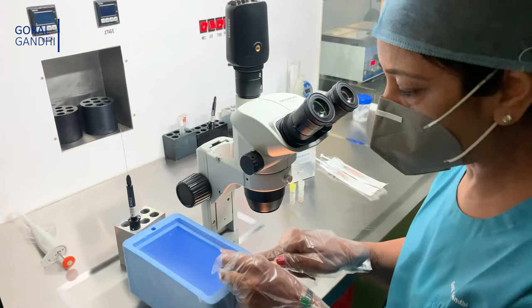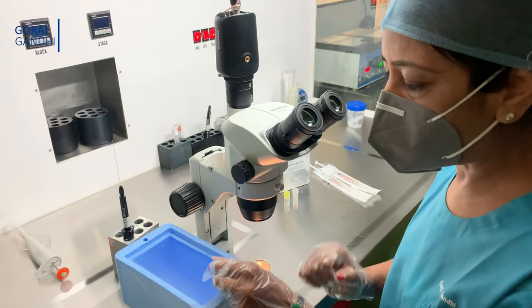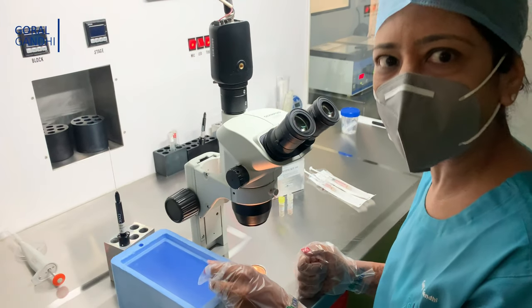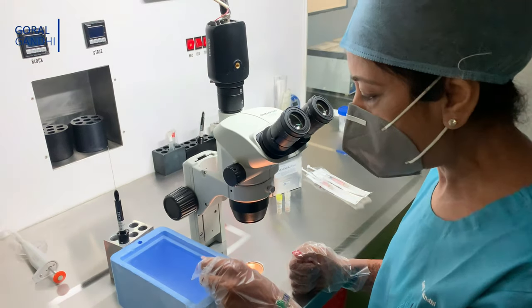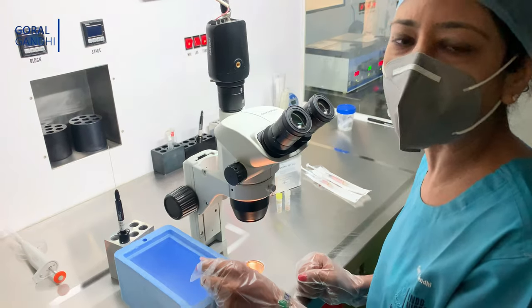I am going to get a very very high warming rate — as high as 42,000 degrees centigrade per minute. So now my embryologist Ditva is going to give me the TS and warm plate, which is kept at 37 degrees.